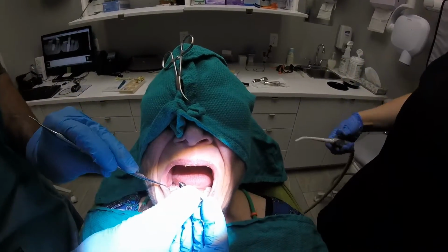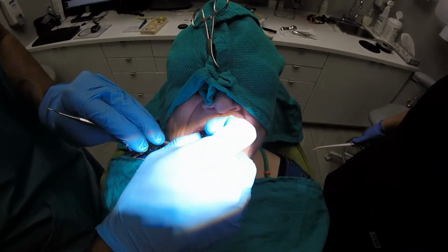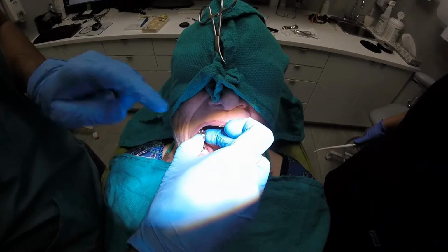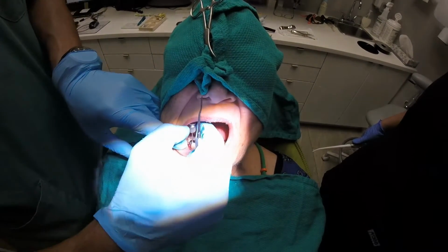At least if you have a clean surface there, it can help sort of clean things up a bit and make sure that when you pop these things off, sometimes you get that smell of things sort of not smelling too good inside the implants. This can sort of help mitigate that.